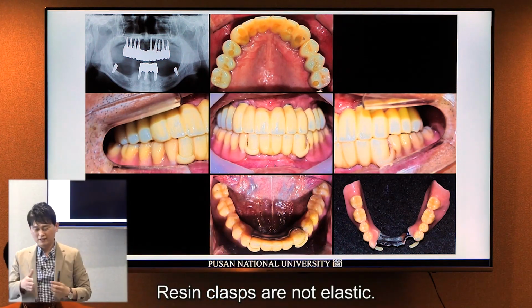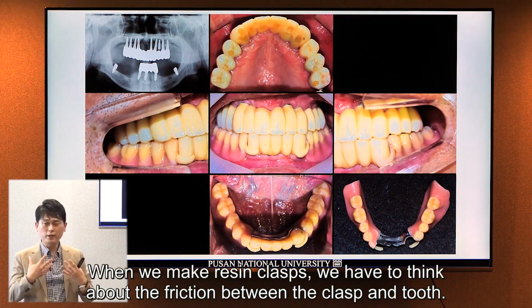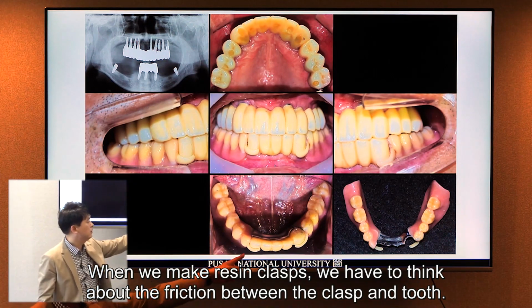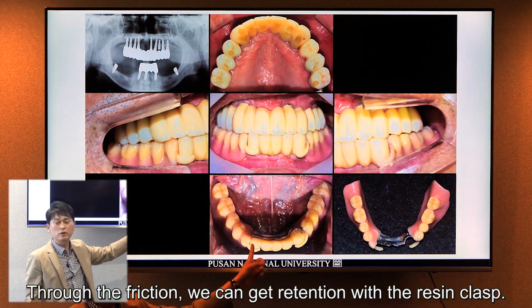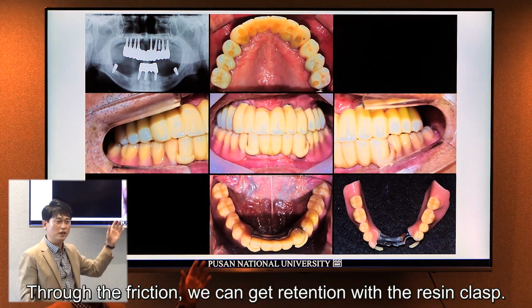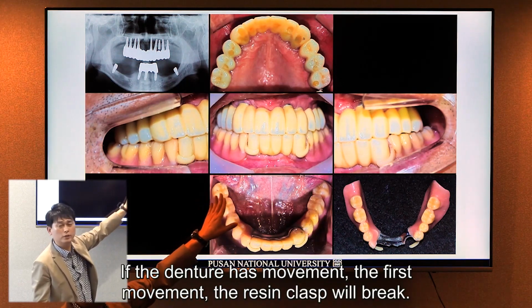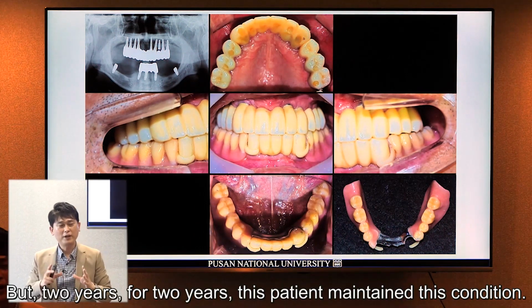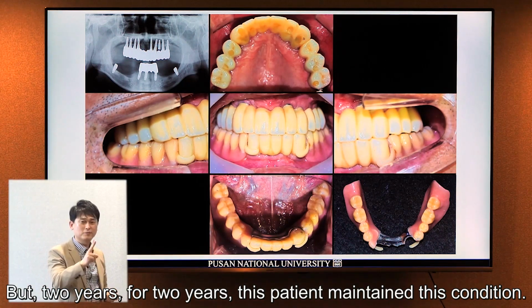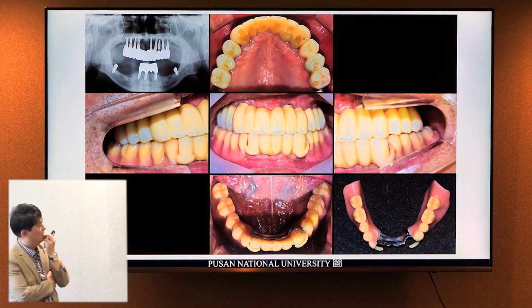A resin clasp is not an elastic material. So because of that, when we make a resin clasp, we always think about the friction between the resin clasp and the tooth. Through the friction, we can get retention in the resin clasp. So if the denture has movement, burst movement, definitely this resin clasp will be broken. But for 2 years, the patient maintained this condition. What's the reason? I'm surprised.